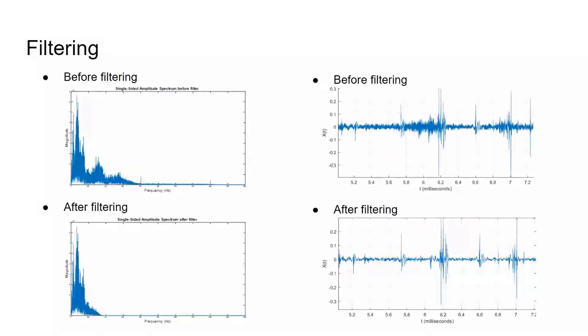Filtering. Noise is a common problem when it comes to any signal processing operation. In the case of phonocardiograms, noise can cause false abnormalities to appear. It is thus very important to minimize the effects of noise. Noise in phonocardiograms can arise from the movement of the patient and other sounds caused by normal functions such as breathing. In this application, a low-pass filter operating with a cutoff frequency of 100 Hz was used.